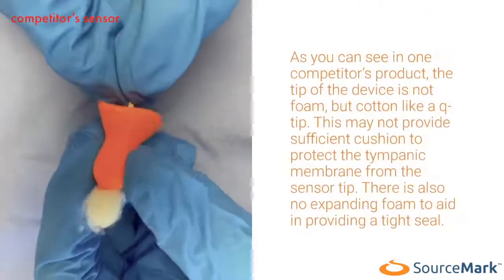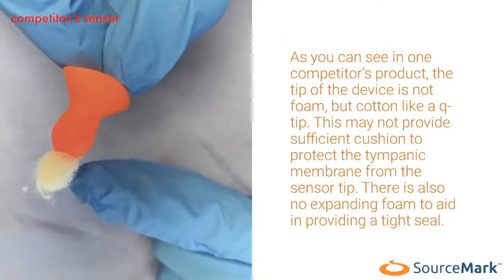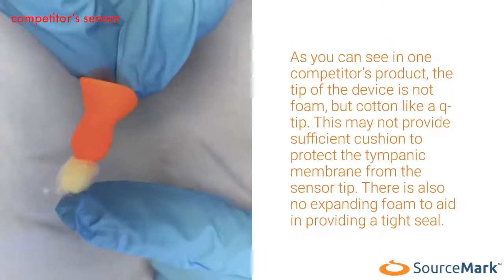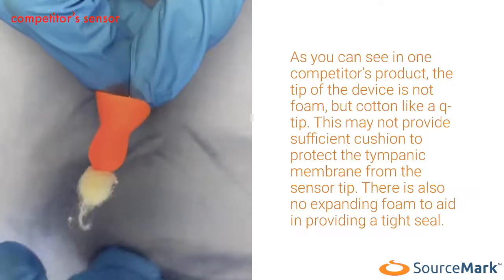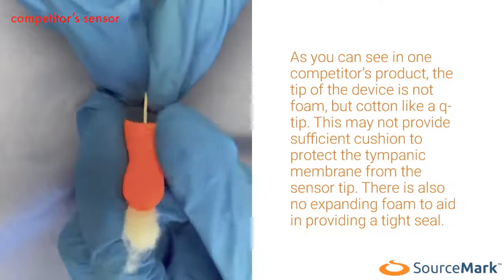As you can see in one competitor's product, the tip of the device is not foam but cotton, like a Q-tip. This may not provide sufficient cushion to protect the tympanic membrane from the sensor tip. There is also no expanding foam to aid in providing a tight seal.